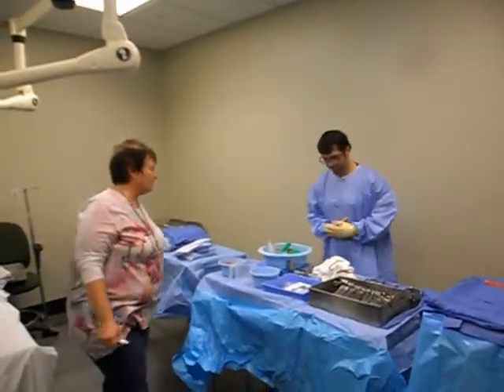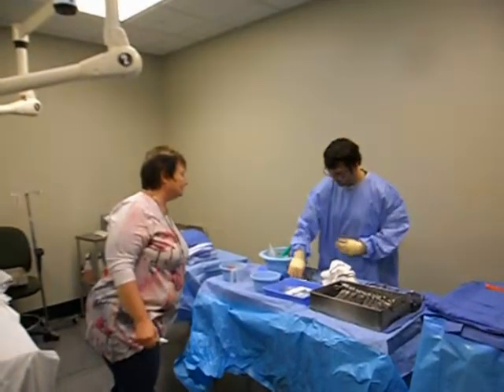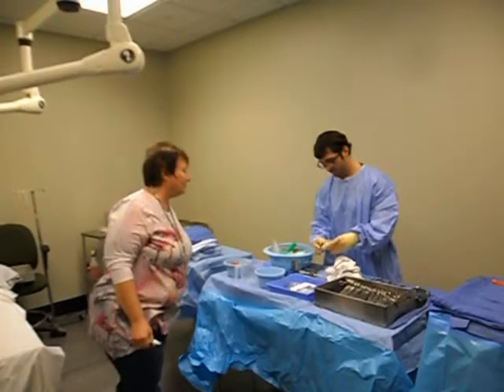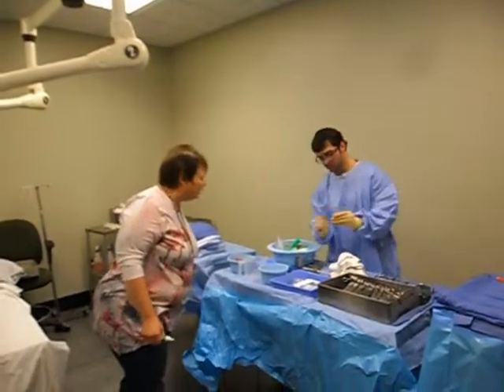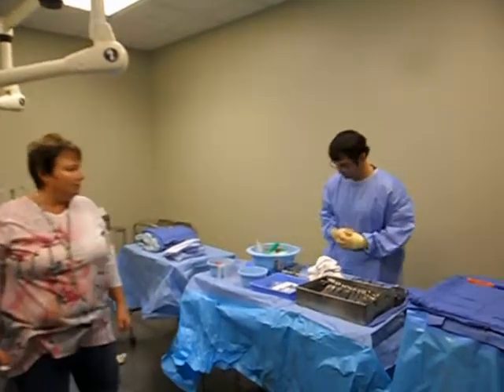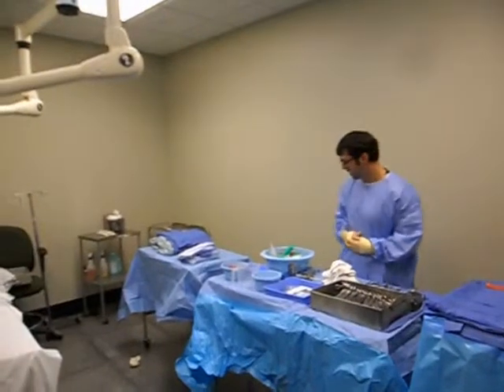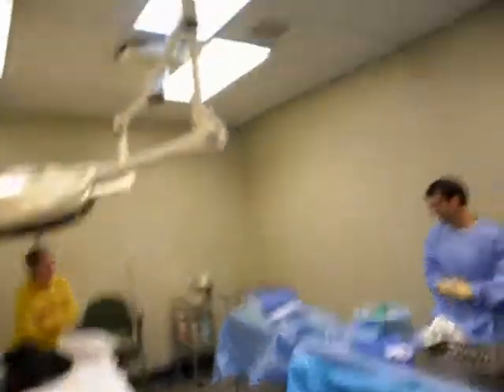10 longs, okay, how many Kittners? 1, 2, 3, 4, 5. Suture booties, how many do you have? Hold them up, let me see them. 1, 2, 3, 4, 5, 6, 7, 8, 9, 10. Suture booties, cautery tip. Do you have a scratch pad or hypo? I do have a hypodermic needle that I'm probably not gonna use. This is just empty. So you don't have any. Probably would ask for a scratch pad.